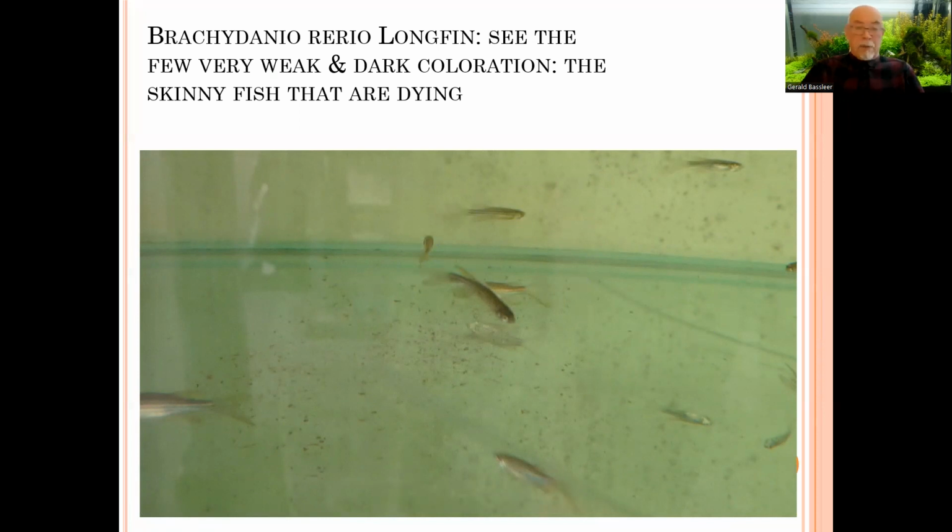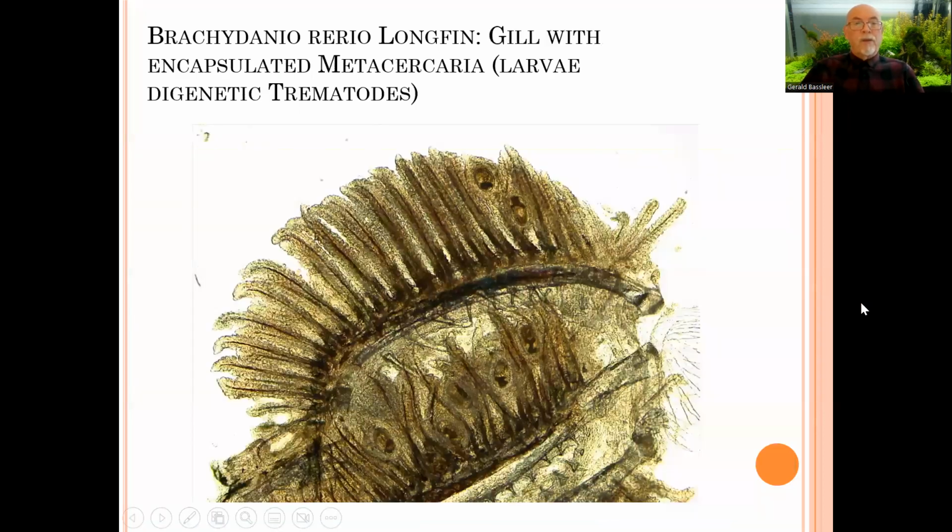Some had less parasitic infection, but that's why we will show you the parasites. And some were stronger and might survive. But the typical thing we found quickly in our examination, when we took some of the gill rays out, is larvae of worms. These are metacercariae, which are encapsulated, and have taken away healthy gill tissue. Look, from this gill part hardly anything is left.